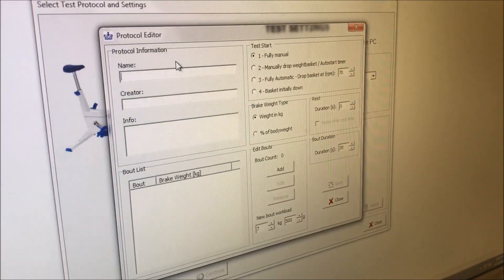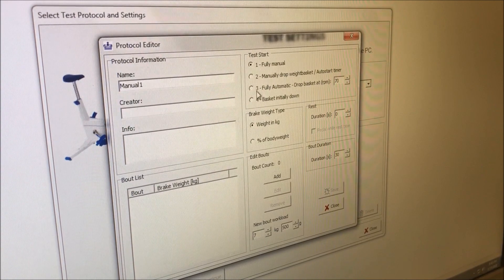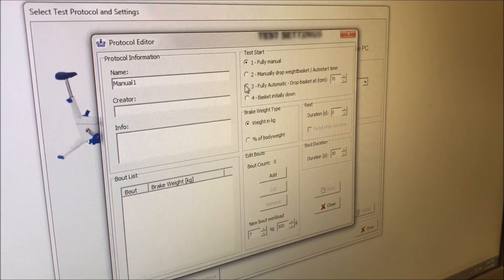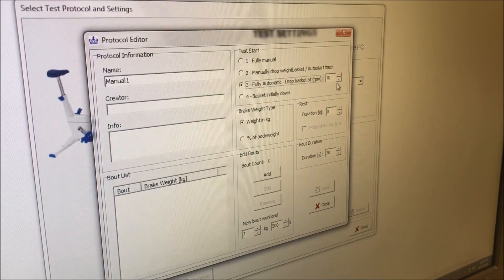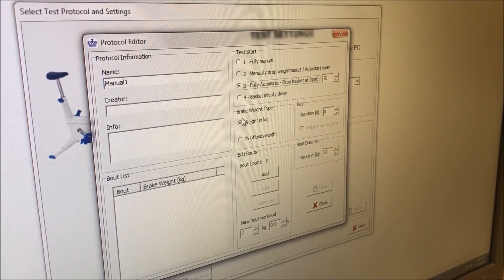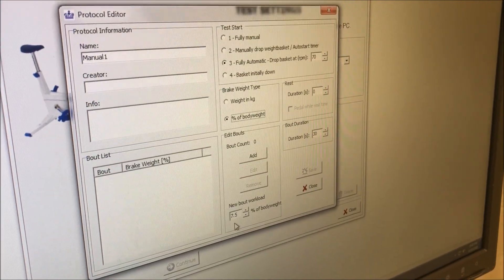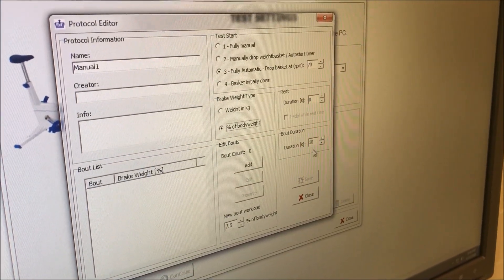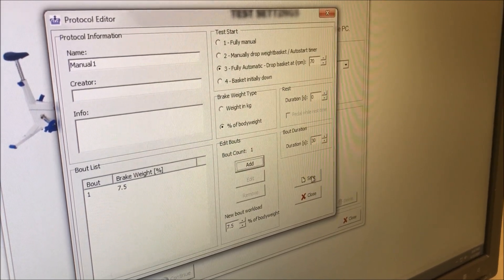I will create a new test, and for the sake of this manual, I'm going to label it 'Manual.' This should be the same setup as the Wingate protocol. I will select fully automatic, and the basket will drop at 70 RPMs. I'm going to select the brake weight type as a percent of my body weight, and that percent will be 7.5. The bout duration will last 30 seconds, and I will add one bout. I will save this protocol.